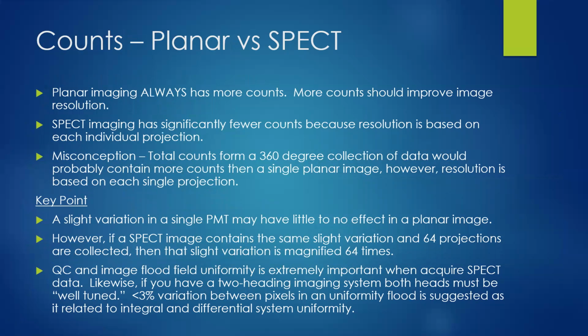So again, let's go back and just reassess this planar versus SPECT image. Hands down, you're probably always going to get better overall resolution on a planar scan because you can go for more counts. But one of the mistakes that some people make when they think about SPECT is they think, well, if I'm collecting 64 stops around a patient, 64 slices, and I add up all the counts coming from all those slices, then my total counts is going to be greater than probably a whole body bone scan. And I would say, hey, you're probably right.